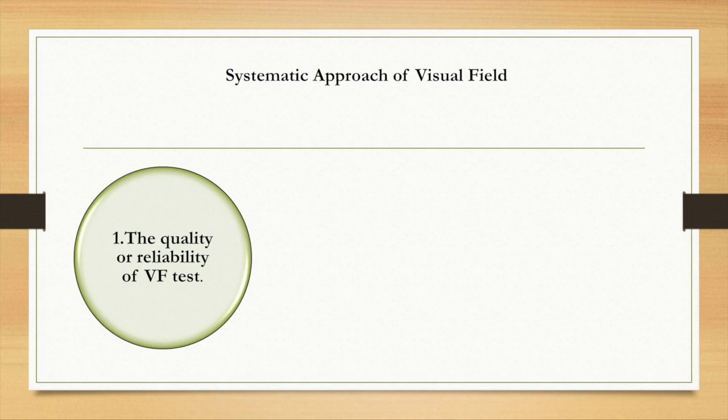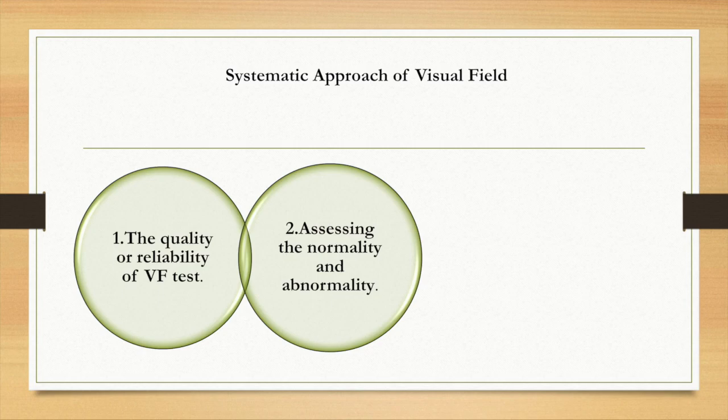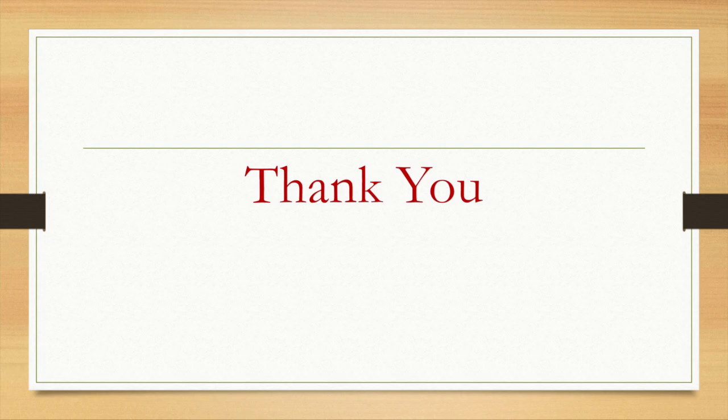In the next presentation, I'm going to talk about a systematic approach of the visual field. I will talk about the quality or reliability of the visual field test and how to assess the normality and abnormality of the visual field, along with how to identify the artifacts. And thank you for listening.